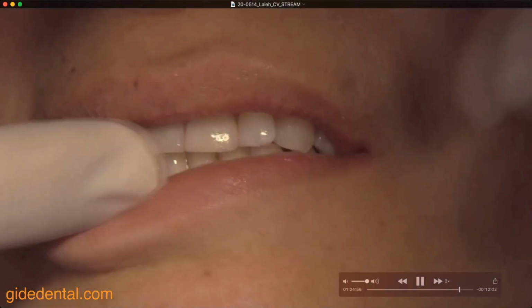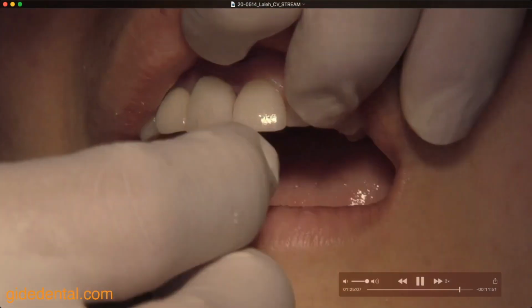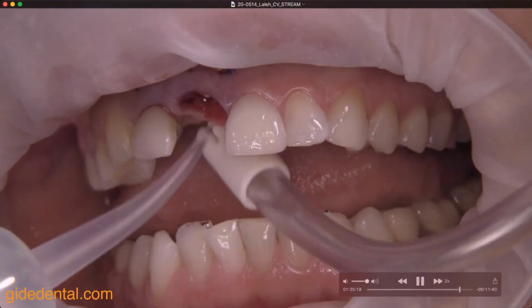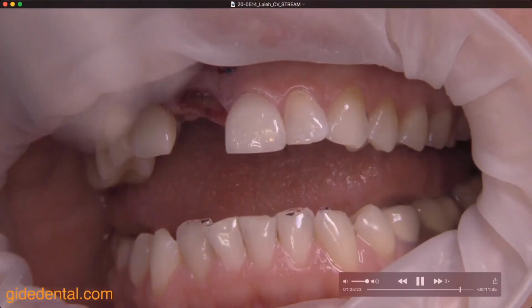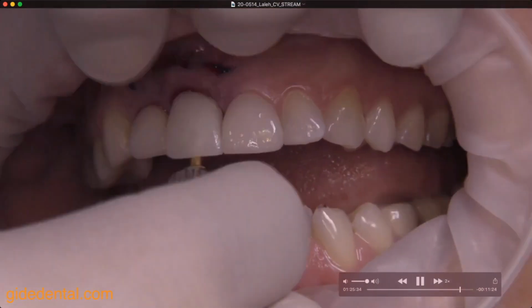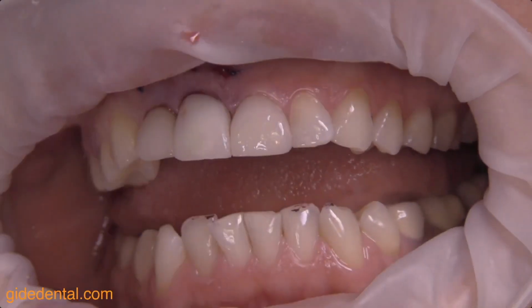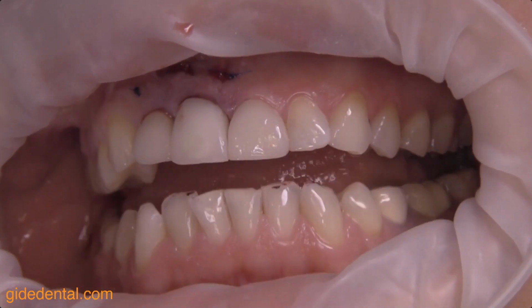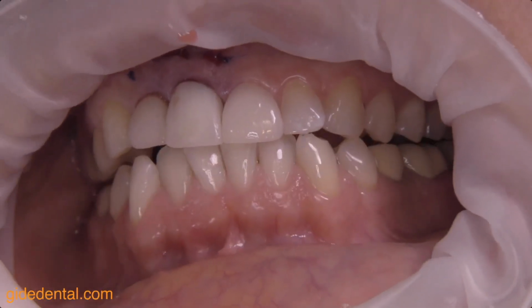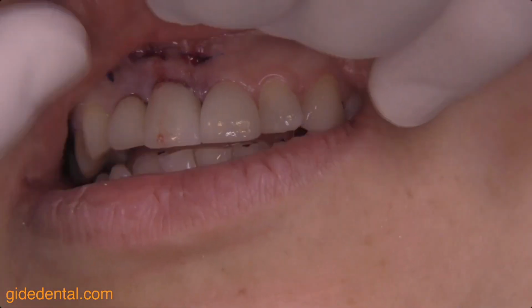You can see the color match is very nice for this patient. And she will go home with obviously a tooth which is really beautiful. We're almost ready. So here's the contour of the tooth. It's under-contoured in the subgingival space, so we can maintain all the soft tissue thickness. You can even see some translucency here in the temporary.